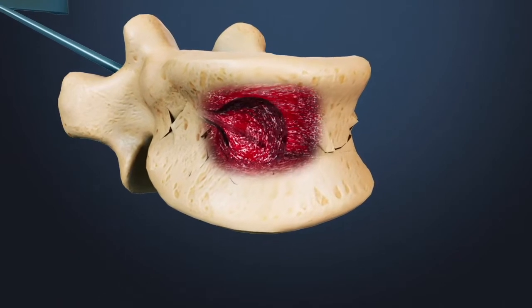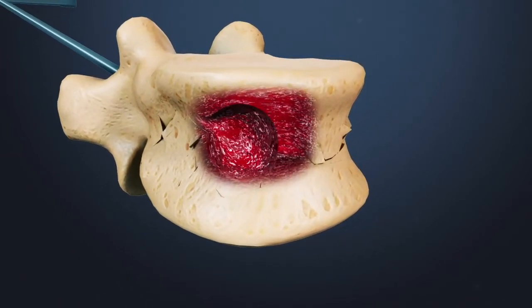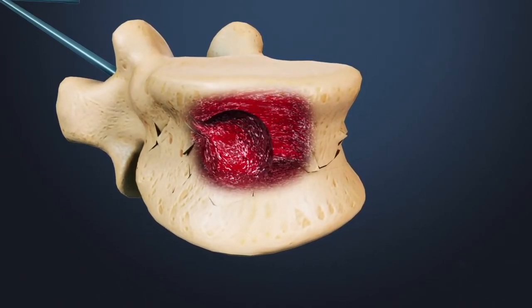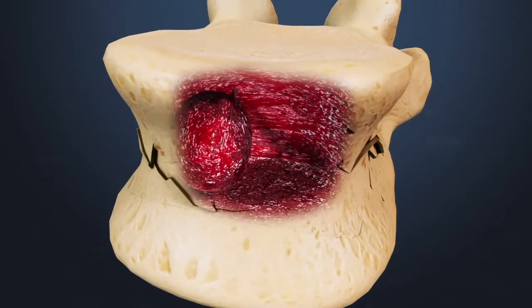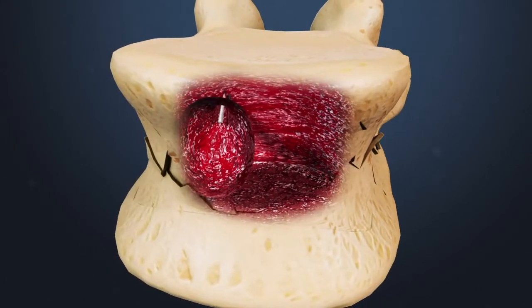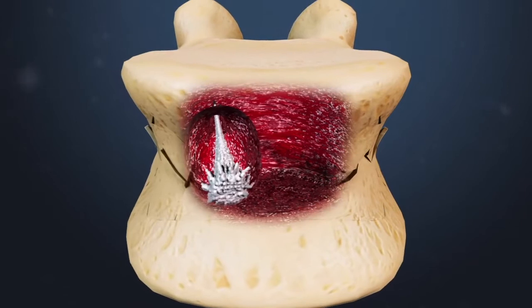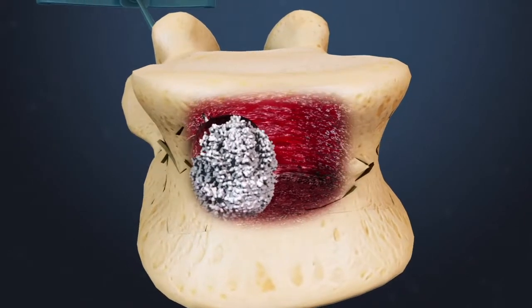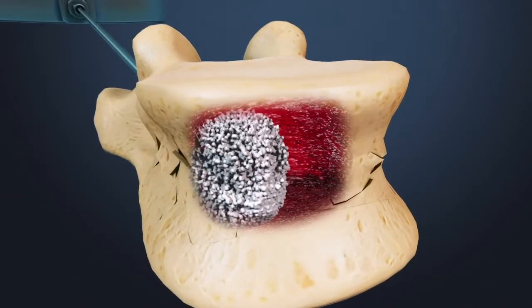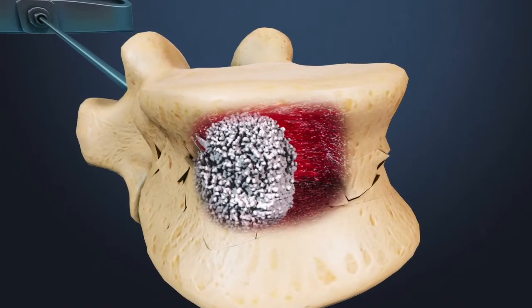The surgeon then deflates and removes the balloon tamp from the vertebra, leaving the new bone cavity behind. A pasty compound called PMMA, a type of bone cement, is injected into the cavity until it is full. The cement hardens quickly, creating an internal cast inside of the fractured vertebra.